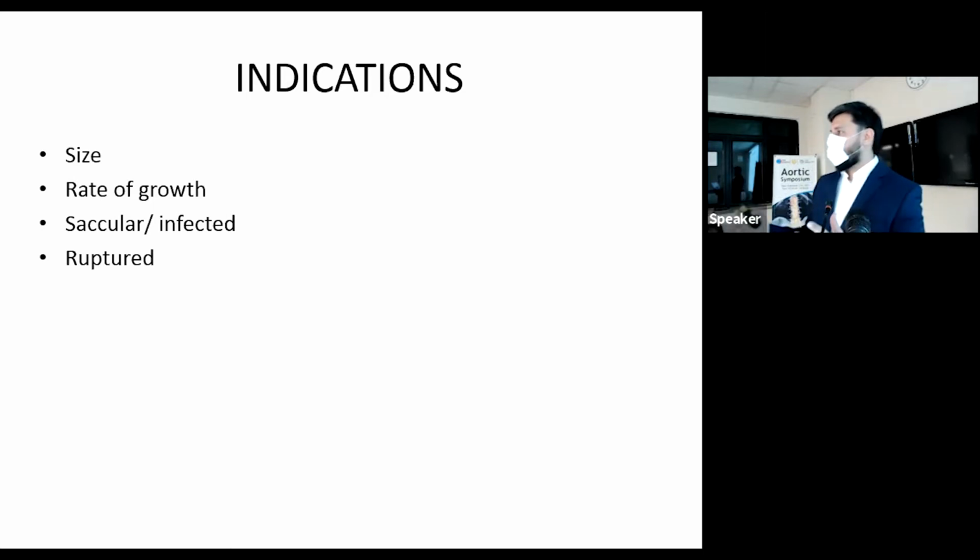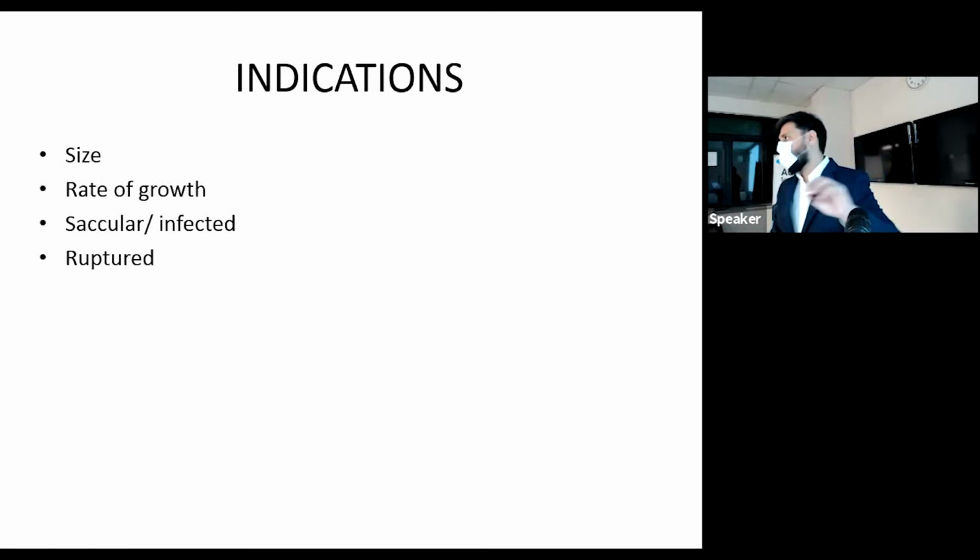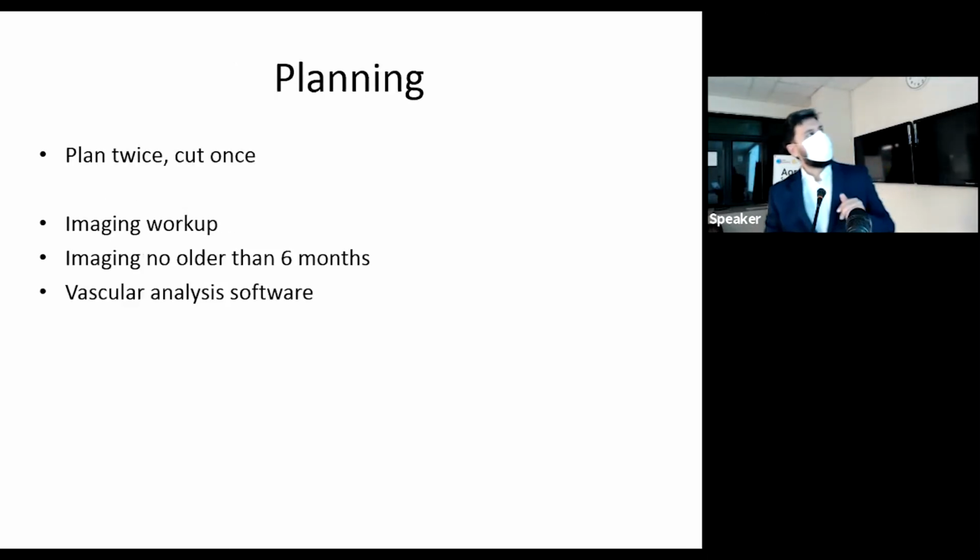Say the iliac artery is really diseased, you might have to put in a stent in the iliac first. Usually you put in the main graft, and then you seal the limbs in the main graft in the body. But in this sort of situation, you might have a really diseased iliac, all sorts of weird, wonderful things like pave and crack, where you put in the limb first, open that up, and then flower pot the main body through that. So it's really cutting edge and interesting for an endovascular surgeon, interventional radiologist. That's just something to think about as well.